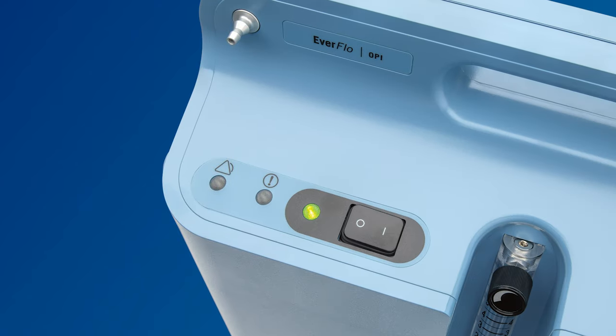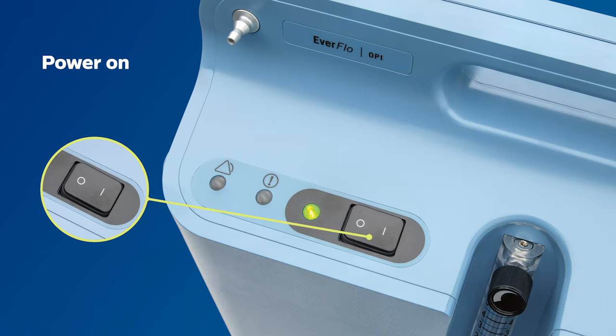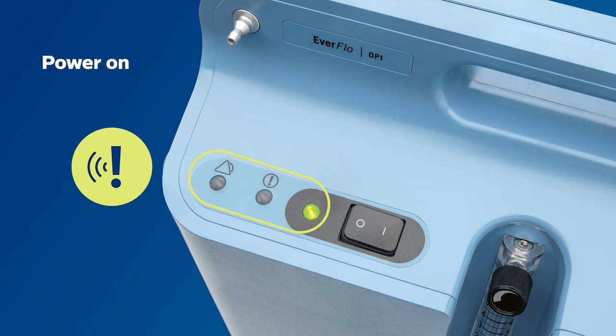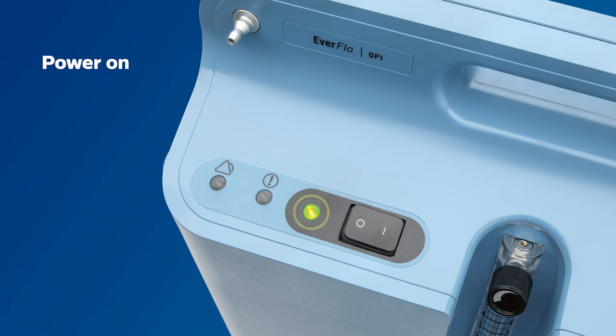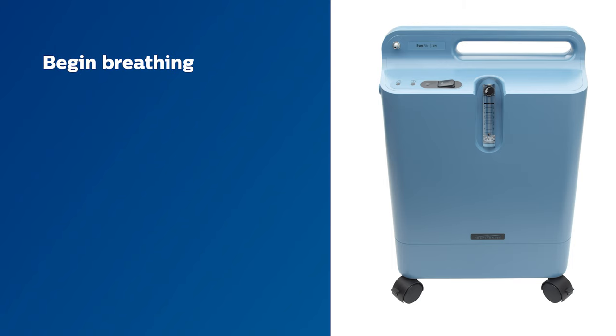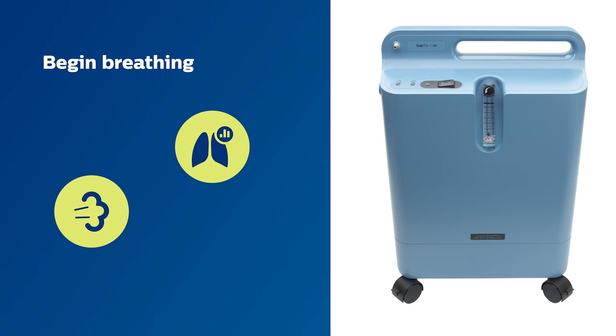Now, let's press the power switch to the on position. At first, all of the LED lights on the control panel will light up and you'll hear an audible alert that will beep for a few seconds. Only the green LED light should remain lit. After turning on the Everflow, you can begin breathing from the device immediately. However, allow at least 10 minutes for oxygen delivery to reach the prescribed level.